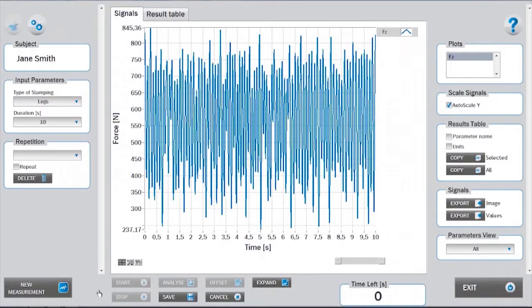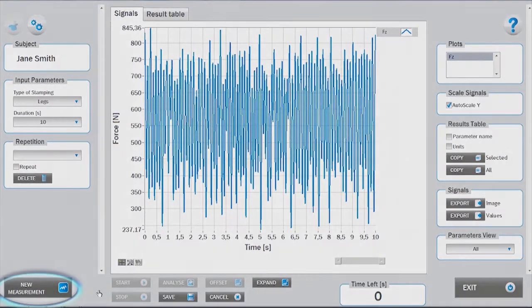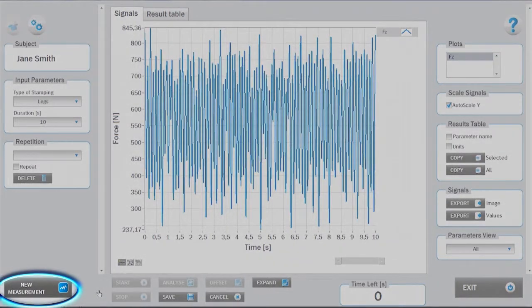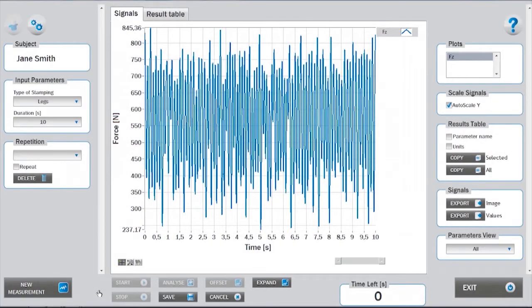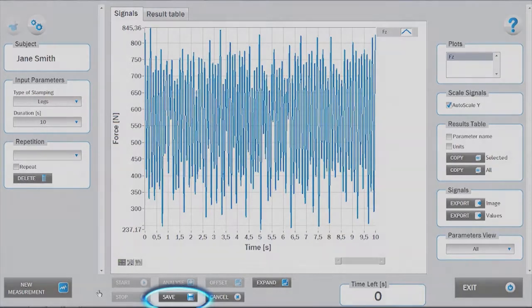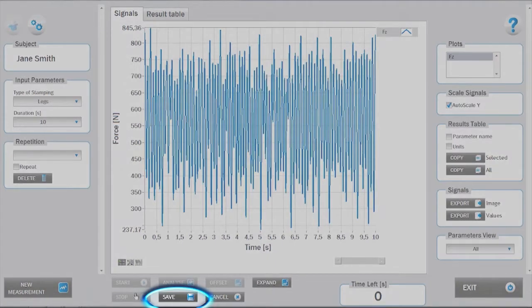The measurement can be repeated by clicking on new measurement, thus not saving the previous repetition. If you are satisfied with the measurement, you can save it.